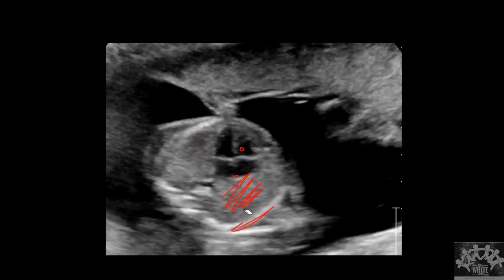So this is what we have learned till now. This is how we see an image. When it is very bright, you think of stone or air. When it is grayer, you think of any soft tissue. When it is looking blacker, you think of any fluid. That's how we interpret.